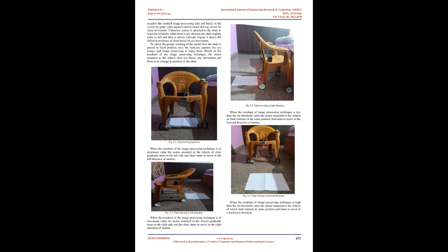C. Features detection and blurring image. To blur the image, a Gaussian blur filter is used, which detects the perfect edges of the specific area of the cropped image. For finding a special pattern on an image which is to be unique, features based on the pattern are implemented. D. Edge detection. Corner edge detection and Canny edge detection algorithms are applied to determine soft edges in an image. It allows easy recognition of circles/rectangles present in the image in order to set a proper threshold value.